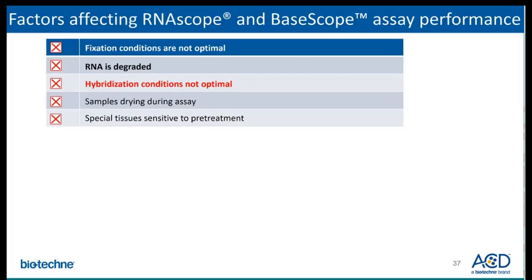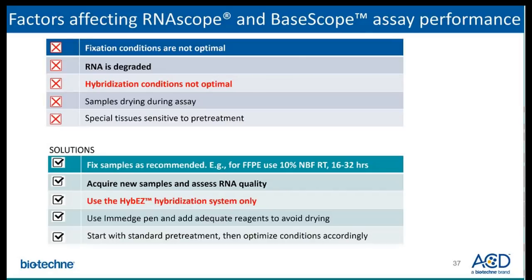When running the RNAscope or BaseScope assay, factors that could affect the outcome of your results include fixation conditions not being optimal or hybridization conditions not being optimal. These issues can be addressed by fixing samples as recommended and using the HybEZ hybridization system for optimal hybridization conditions.